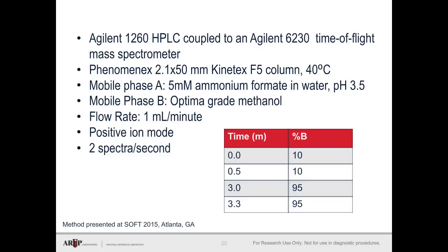The method uses an ESI source with a scan speed of 2 spectra per second. The gradient is pretty simple, and the whole thing is less than 4 minutes injection to injection.